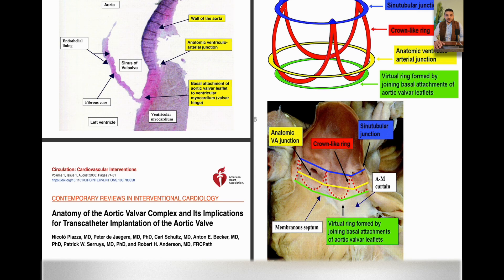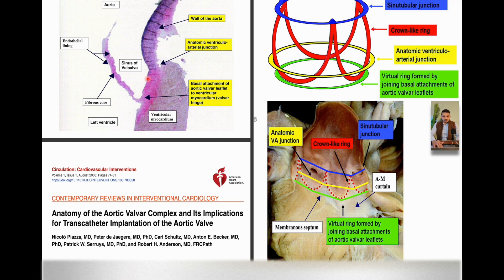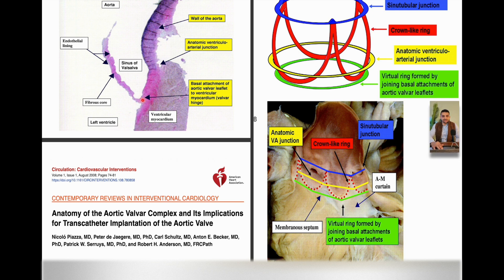As you can see here, this is the anatomy of the aortic valve complex and its implications for the transcatheter implantation of the aortic valve. The aorta is embedded into the LV. This is the anatomical ventricular-arterial junction, and this is the aortic leaflet. The aortic leaflet is not attached to a fibrous skeleton in the LVOT — it's attached directly to the LVOT muscular.